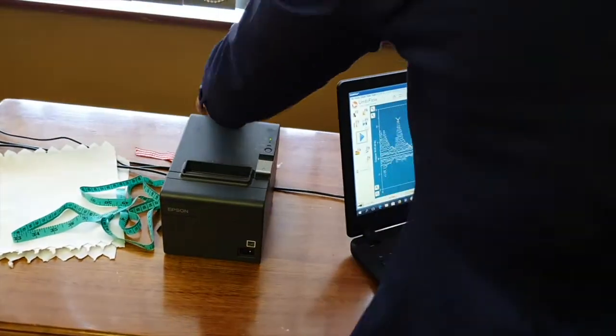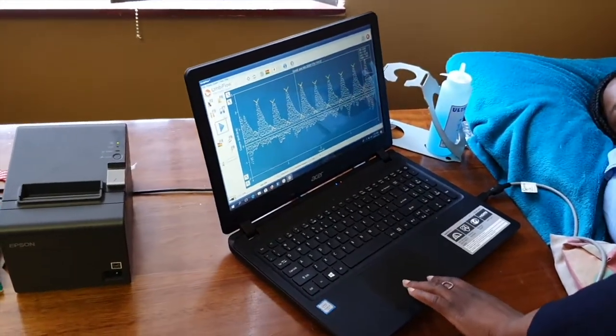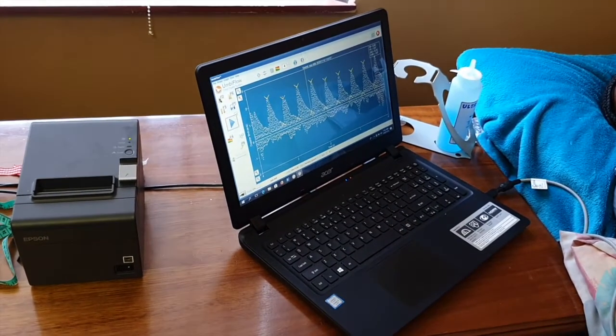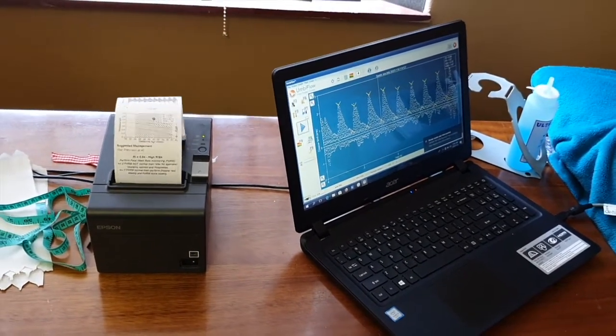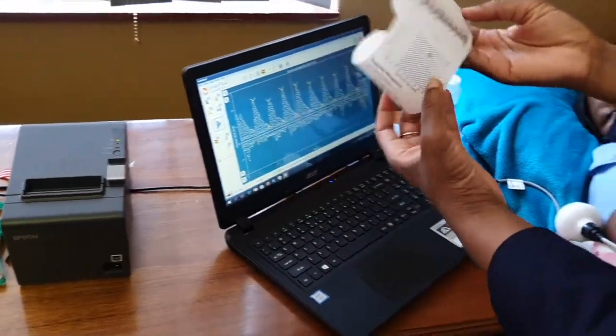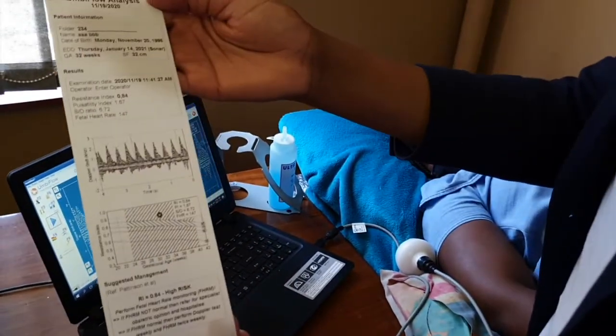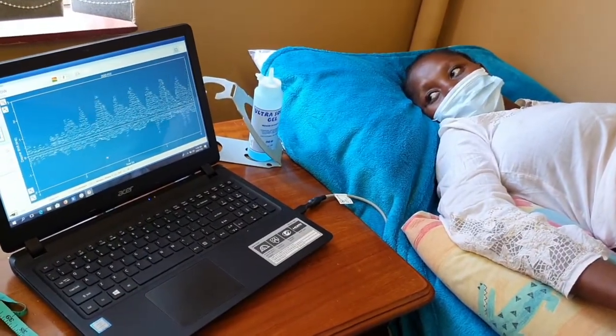This was her audible waveform. Her result is printed on the invoice printer. The printout shows the obtained resistance indices, the Umbiflow waves, the graph, and the classification according to the centiles.